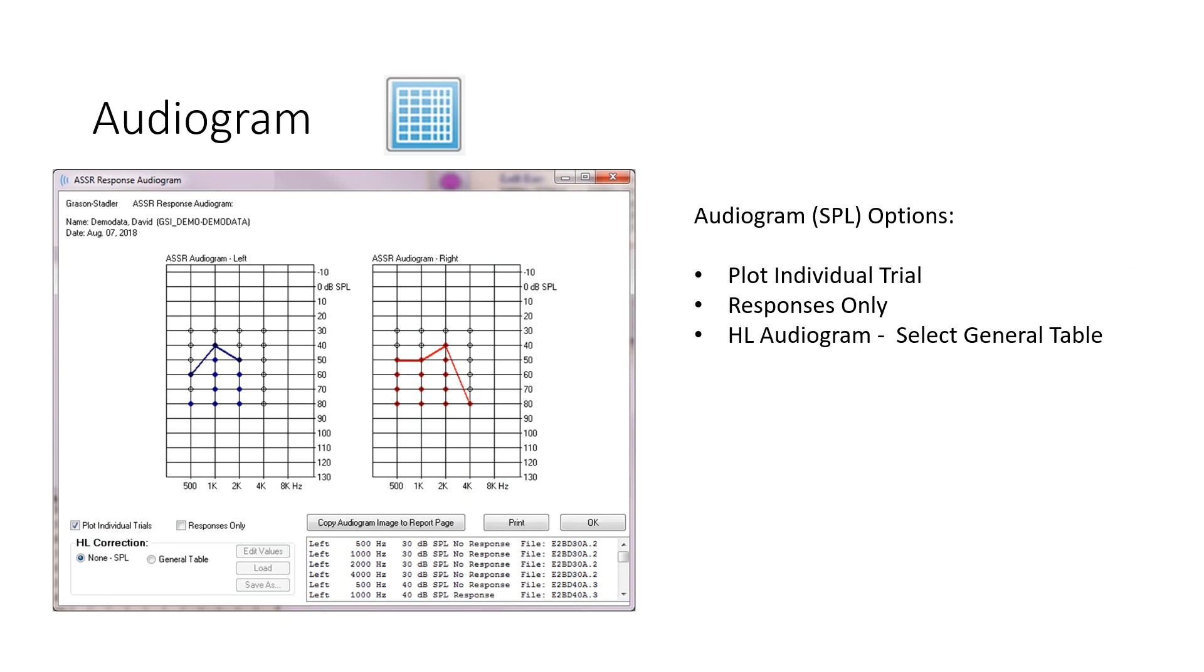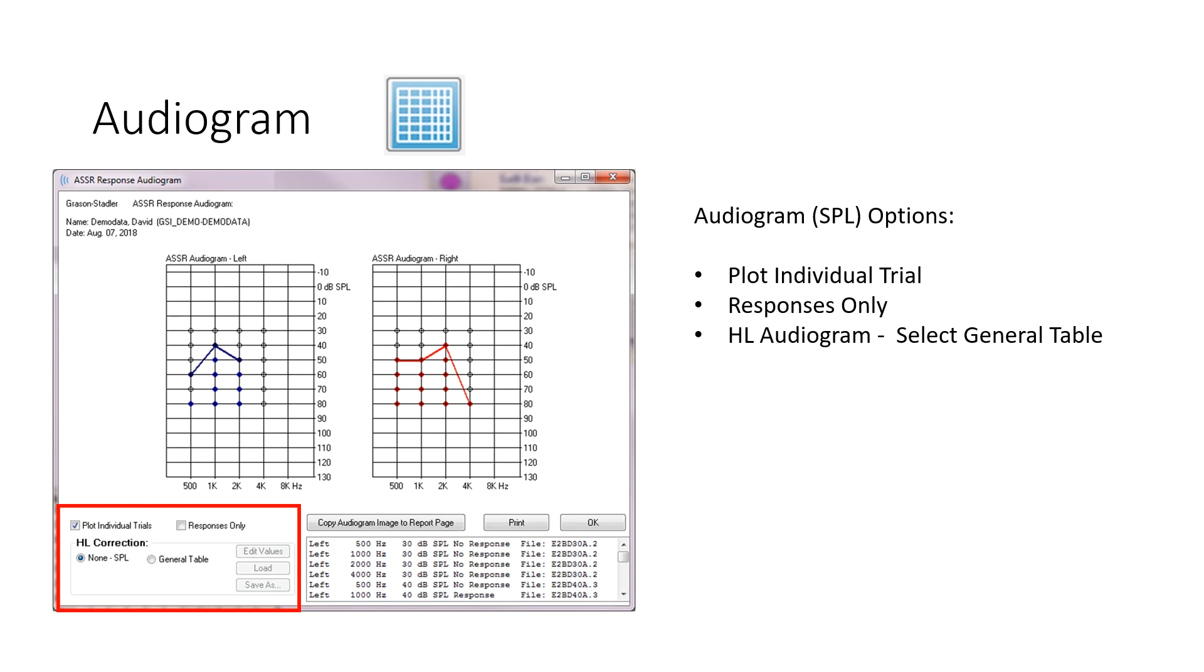Moving on to the audiogram. So if you select the audiogram, here you can also see the significant responses that are plotted. In the lower left corner of this window, you can select Plot Individual Trial Only, or maybe just Responses. In this case, we're looking at every individual trial.